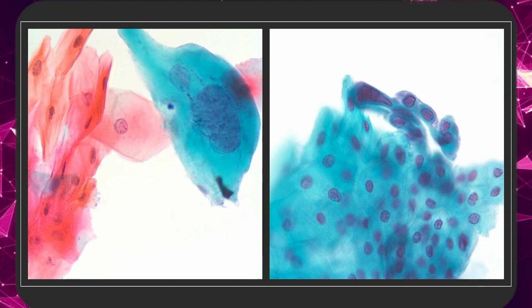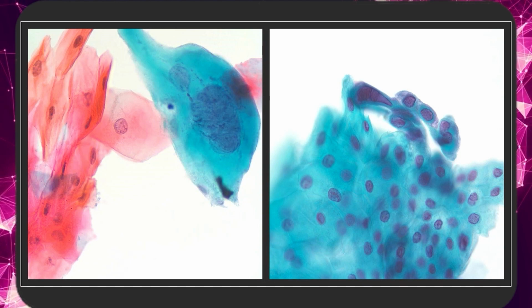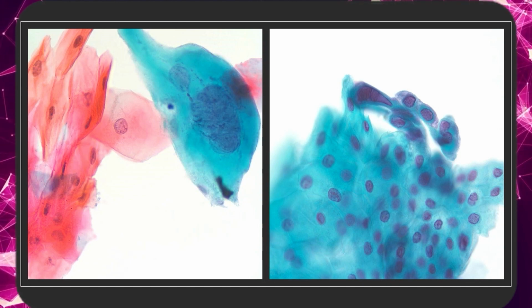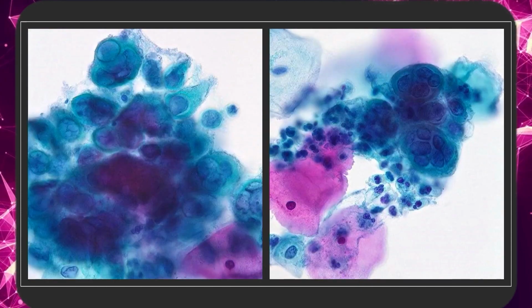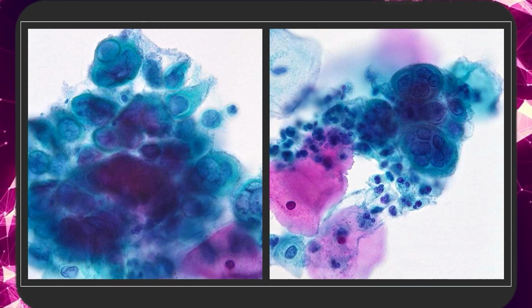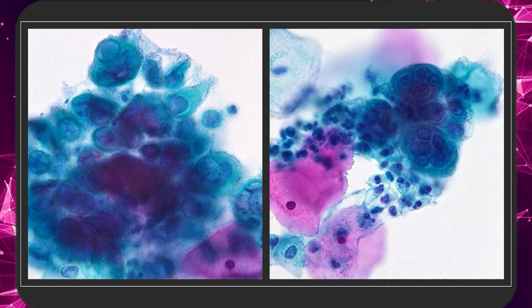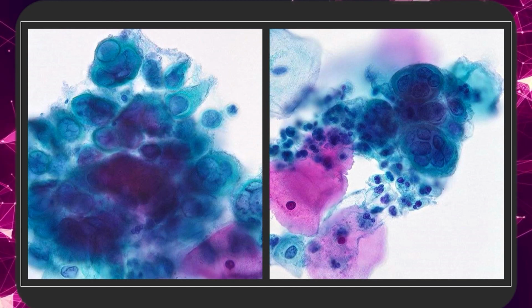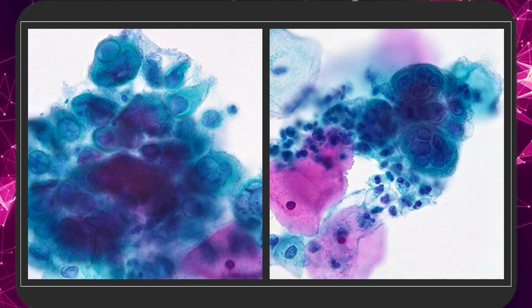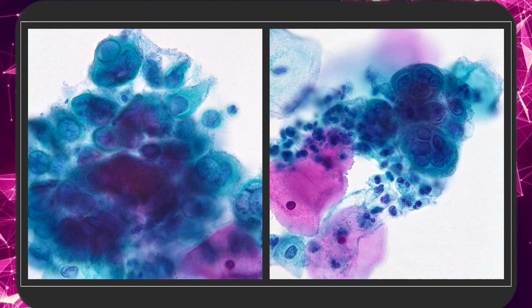So just to give you the differential, that is herpes. Some resemblance to our case, as you can see here, but why would every single nucleus look like a herpetic nucleus? That would be unusual. Herpes in a Pap test, again, amazing resemblance to our case, inclusion-like, but our case was nested, papillary, and herpes infection of which cell? It's forming a mass. So it's not like it's infecting an esophageal lining. So it's clearly a mass. Maybe it's an ectopic pancreas infected by herpes.